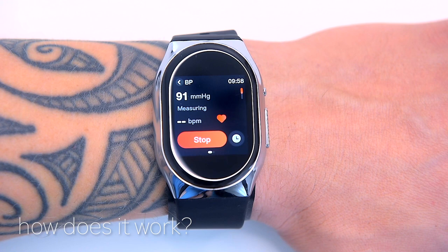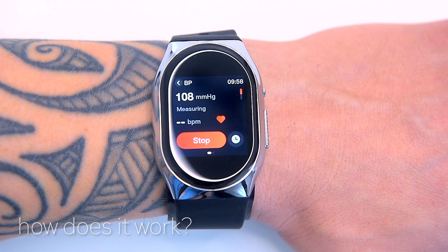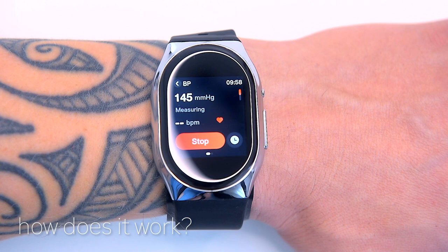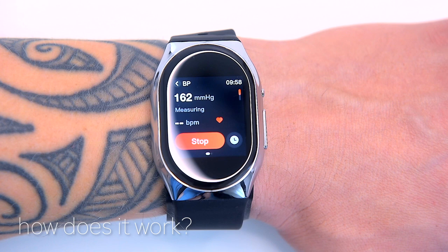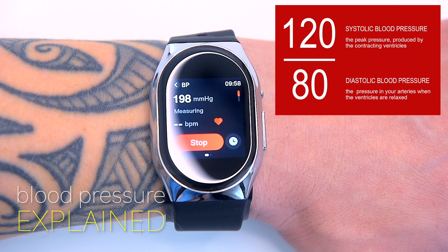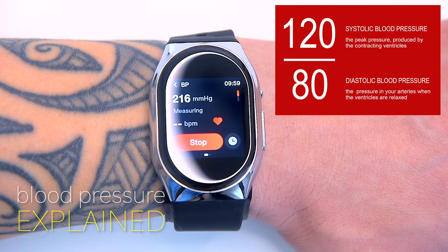Blood pressure is traditionally taken using a sphygmomanometer, consisting of a stethoscope, arm cuff, pump and dial, or an upper arm oscillometric device, which is a pain to use. BP Doctor Pro has miniaturized all the necessary pumps and valves to create a patented inflatable cuff design. For those who aren't sure what the two numbers mean: the systolic pressure, the higher number, is the force at which your heart pumps blood around your body. The diastolic pressure, the lower number, is the resistance to blood flow in the blood vessels, measuring the pressure in your arteries between beats.